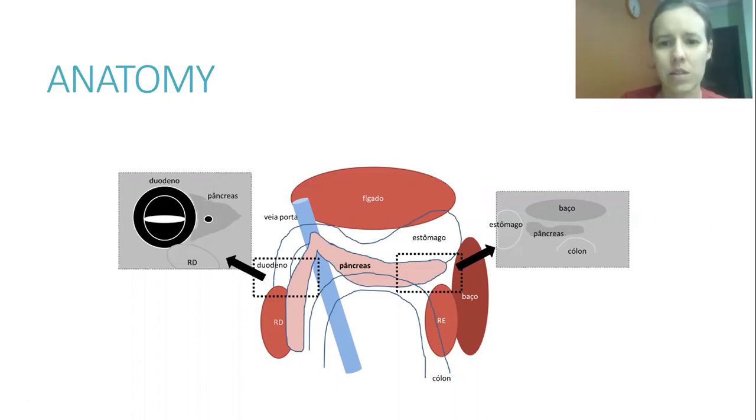In this picture we have the pancreas shown in pink. We can remember that it has a relationship to the portal vein. We can see the stomach, pylorus, and duodenum here. The right kidney is very close to the right lobe of the pancreas. On the other side, we have the spleen, the left kidney, and the colon passing very closely to the left lobe of the pancreas. Remembering these landmarks will be important when looking for the pancreas.